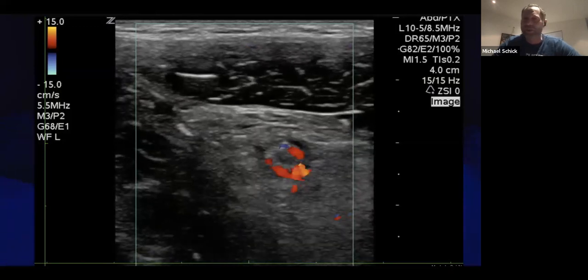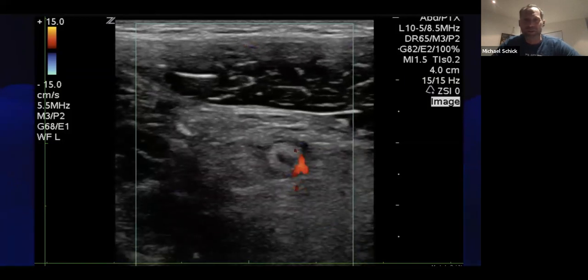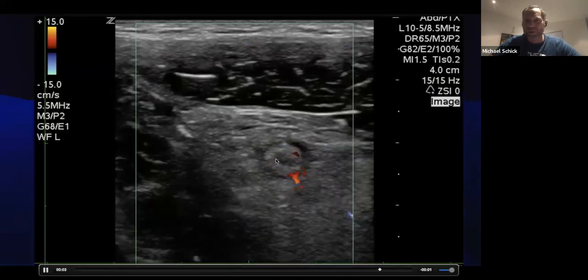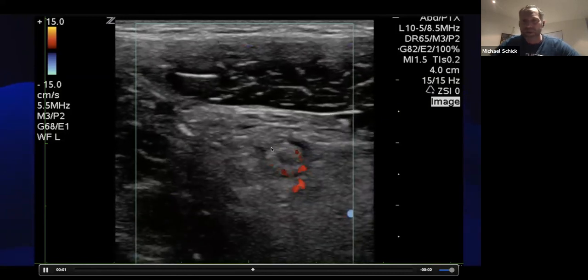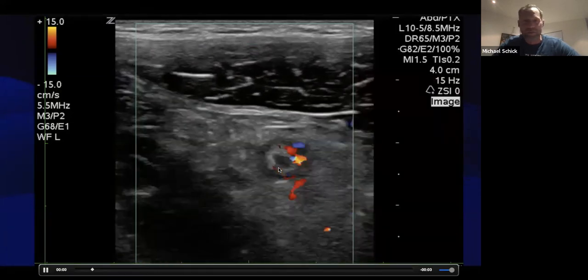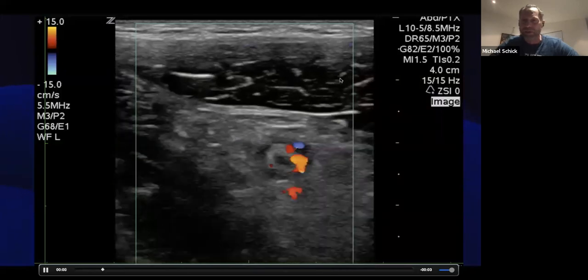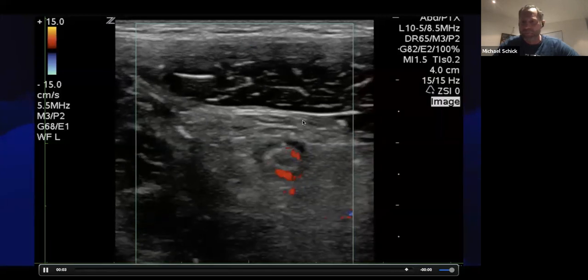Like I said, this is the ultrasound. After you ask the patient, where's the pain? You put the probe on. You're using a linear probe, as you can see here. And you found this sort of tubular structure that looks edematous, perhaps dilated, and has very hyperemic color flow here, sometimes described as a ring of fire. Other structures just in the area that you might notice is you have intra-abdominal muscle here, psoas muscle here, and this is probably the peritoneal line right here. So we're talking about appendicitis.